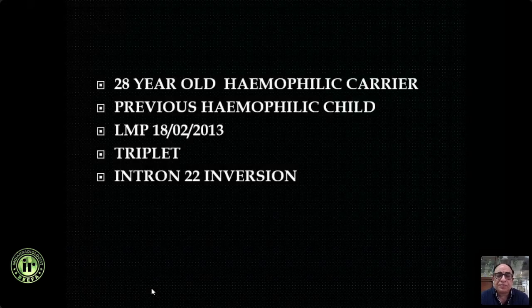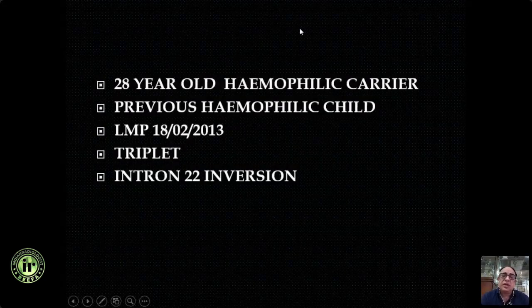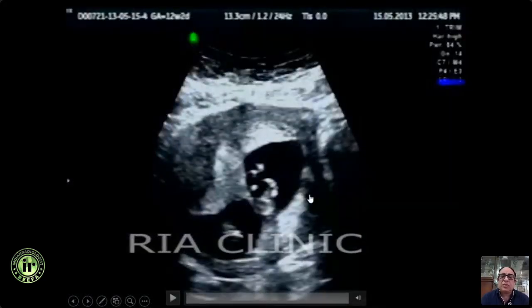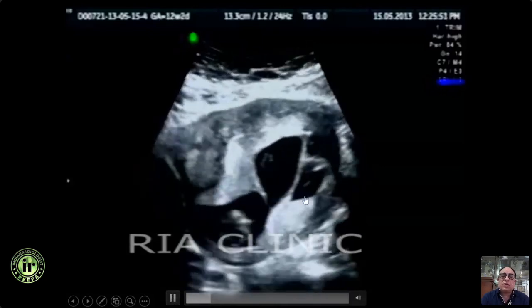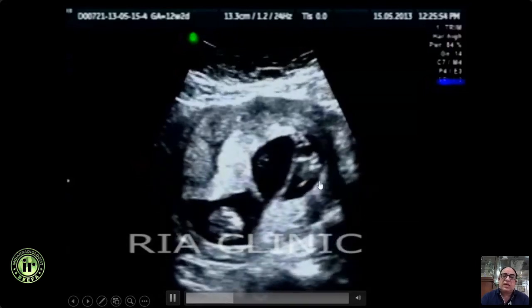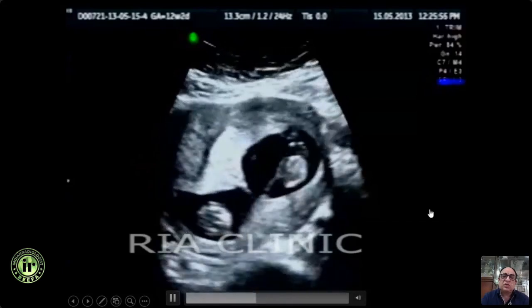It's faster. There are times where you have more than twins, you have triplets, because now with infertility treatment, and this was one case, and many of them are carriers of some disease. And before you do a reduction, they need to know whether all the fetuses are involved or not. So this was a triplet. The mother was a hemophilic carrier. So we had to do a CVS of all the 3. And one of the fetuses tested hemophilic positive. And then we would do a reduction of that particular fetus. So this can be a trying task.